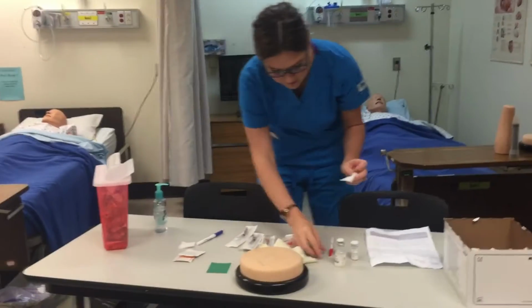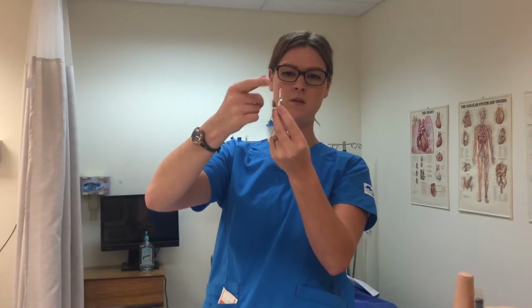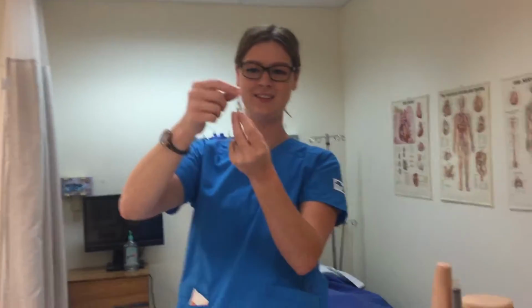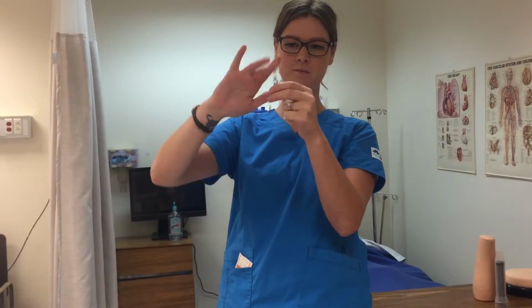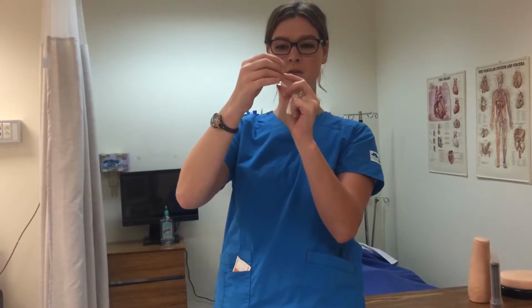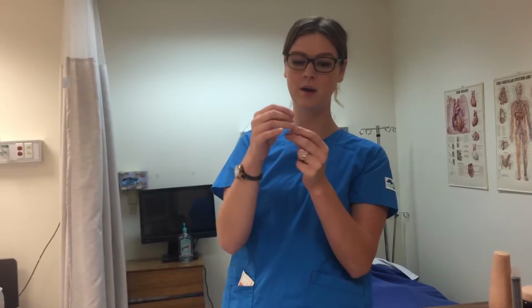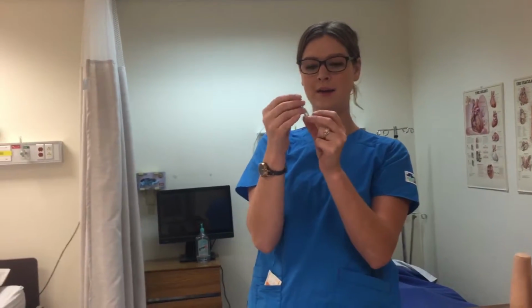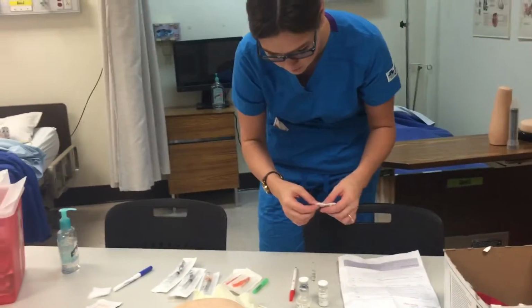So I'm going to take my 2x2, I'm going to check my glass ampule, I'm going to tap it to make sure all the liquid goes to the bottom. And all the liquid is now at the bottom. If I was using this for a patient, I would do the 6 rights according to the MAR, but I'm not. This is just for my demo, and it has not expired. Always check the expiration for everything you pull.